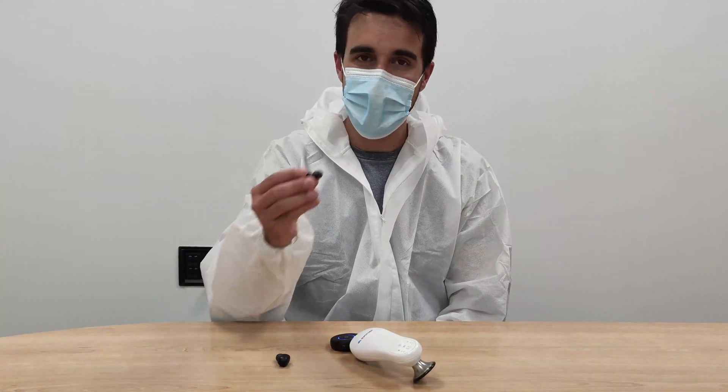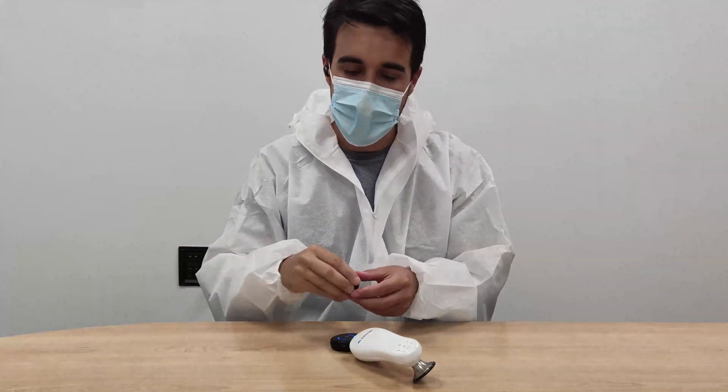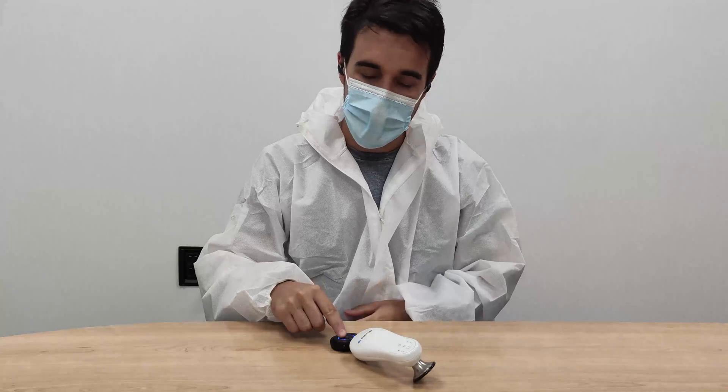The next time you want to connect the Bluetooth module to the earbuds, just turn them on and they will connect in a few seconds automatically.